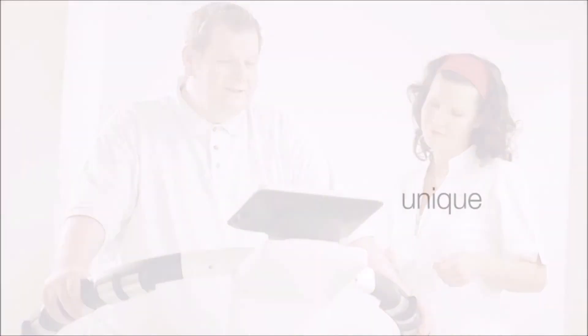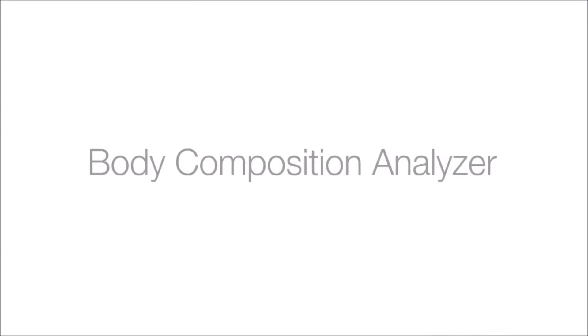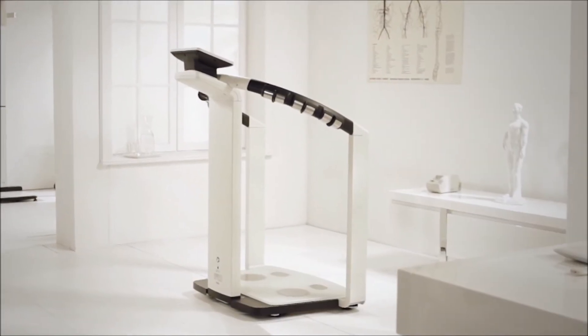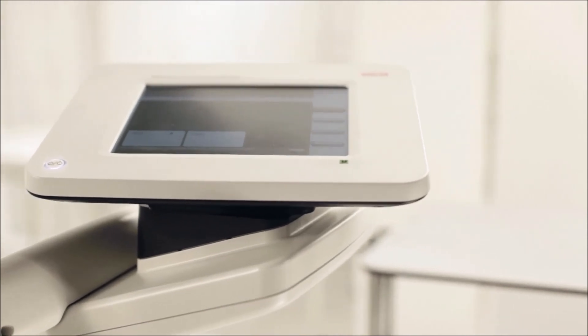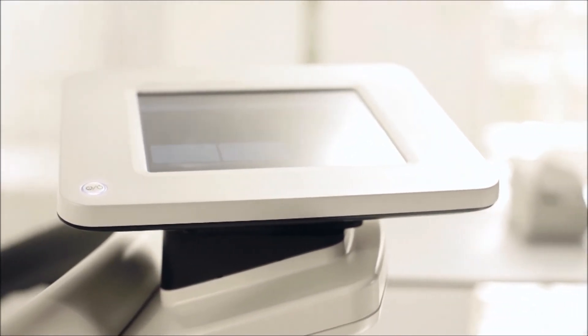For this reason, Cica has developed a unique body composition analyser that delivers all these values — the Cica MBCA, with an M for medical. The first body composition analyser in the world that measures body composition with enough precision for medical purposes.